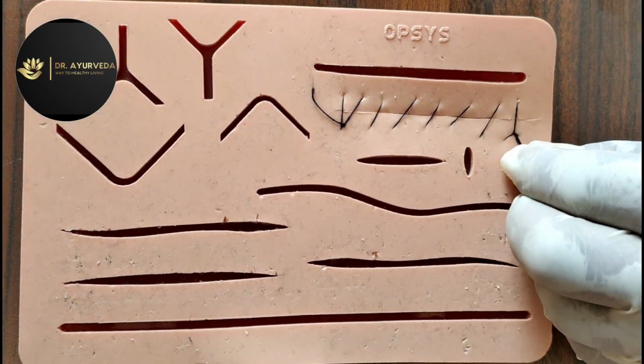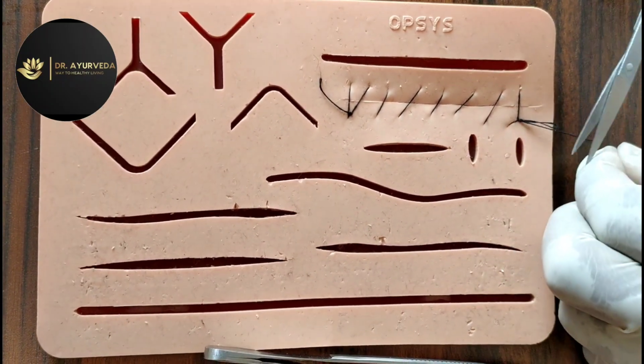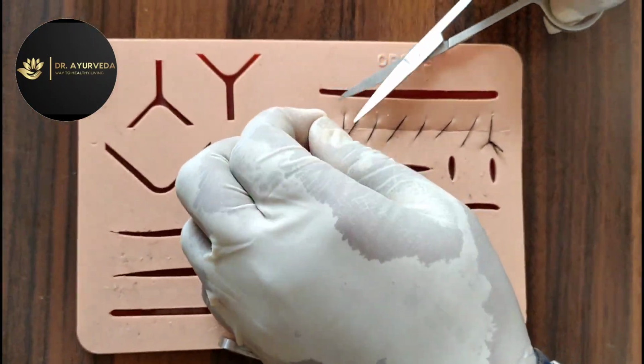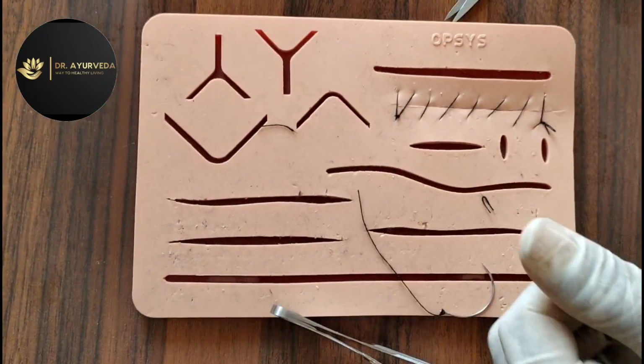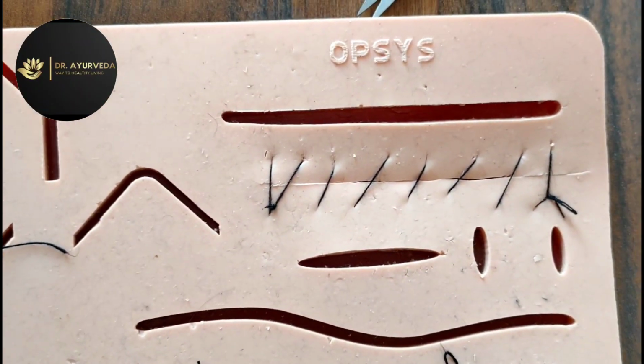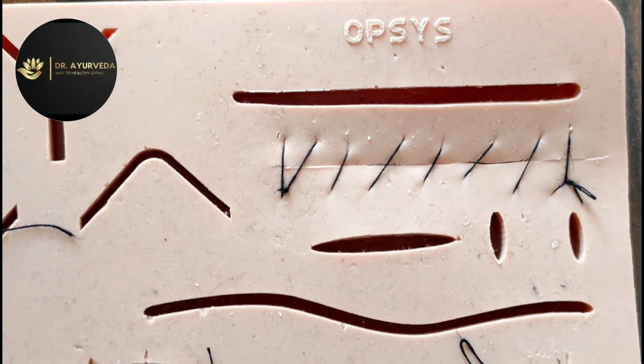Thus, the locked stitches help to hold the previously placed portions of the continuous suture tight as the operation is completed. Locking involves passing the suture through the previous suturing cycle.